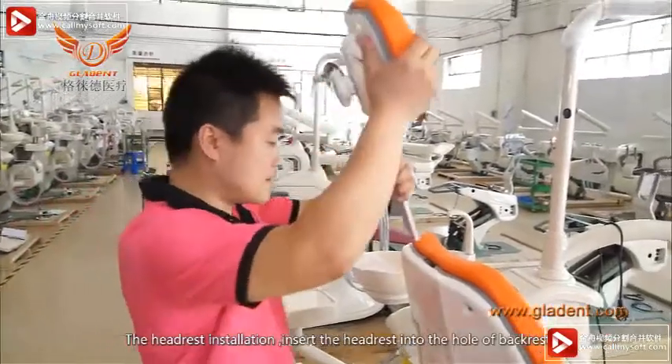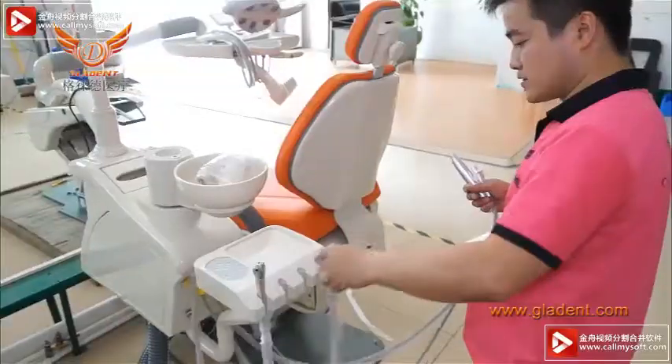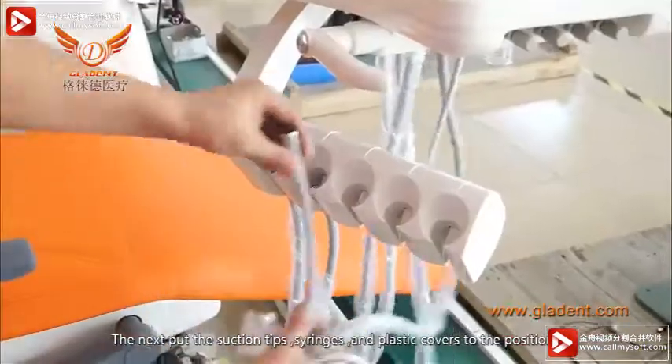Headrest installation: insert the headrest into the hole of the backrest. Next, place the suction tips, syringes, and plastic covers into their positions.